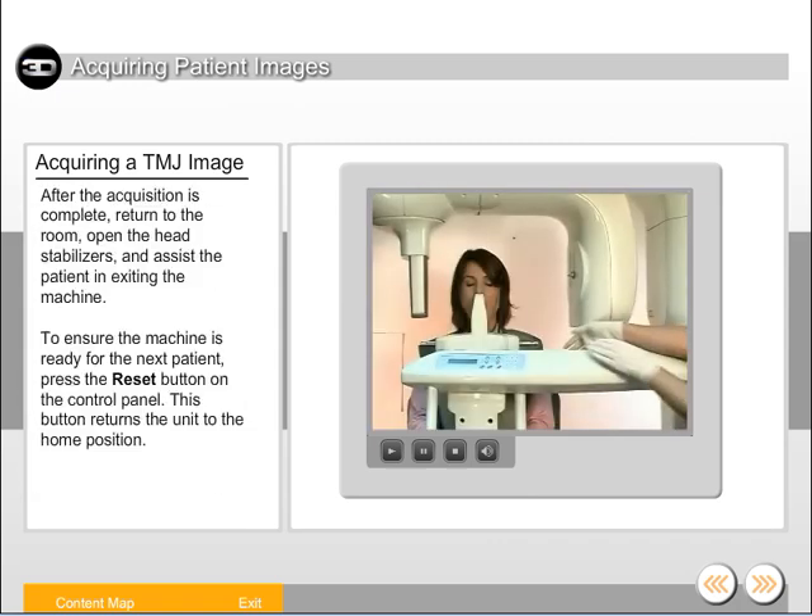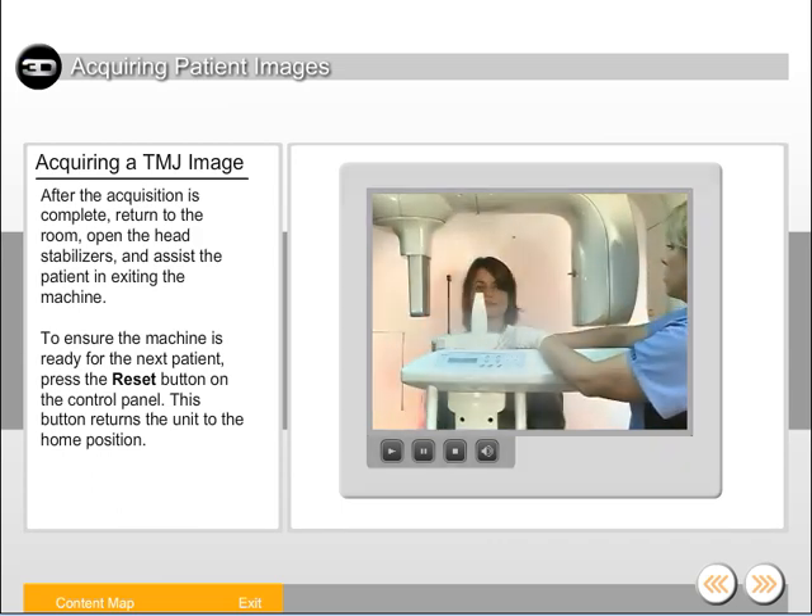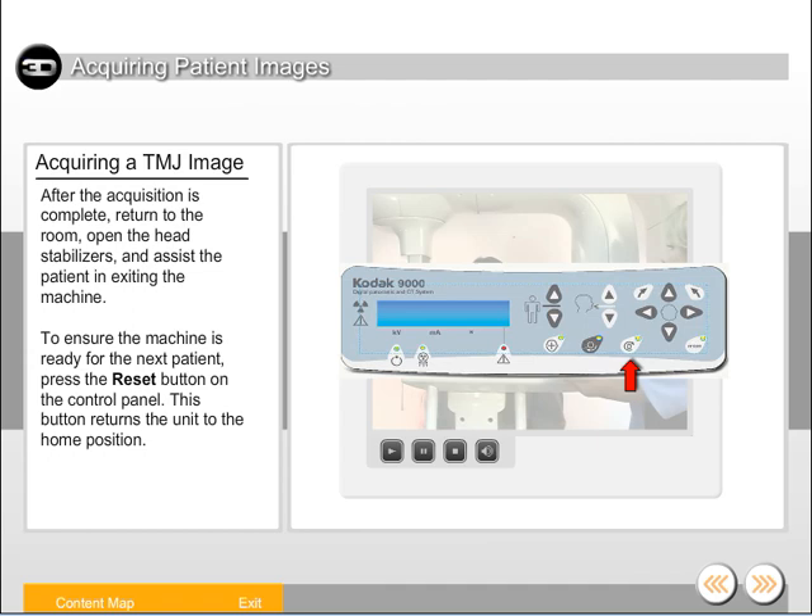After the acquisition is complete, return to the room, open the head stabilizers, and assist the patient in exiting the machine. To ensure the machine is ready for the next patient, press the reset button on the control panel. This button returns the unit to the home position.